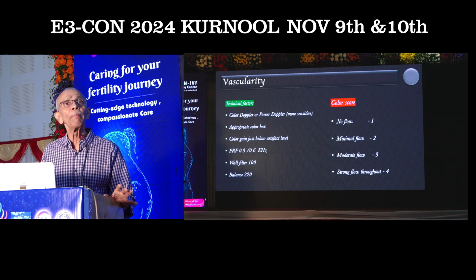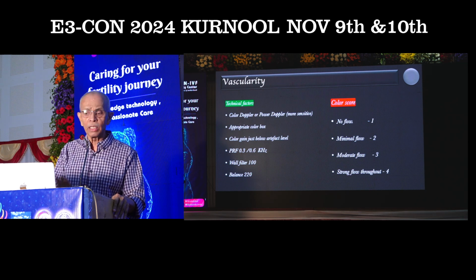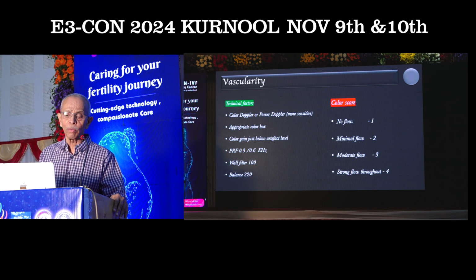Then wall filter and balance, usually we don't tamper with them, but the wall filter should be about 100 and the balance should be about 220.